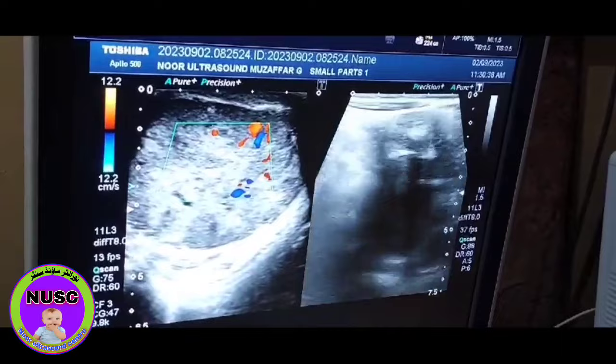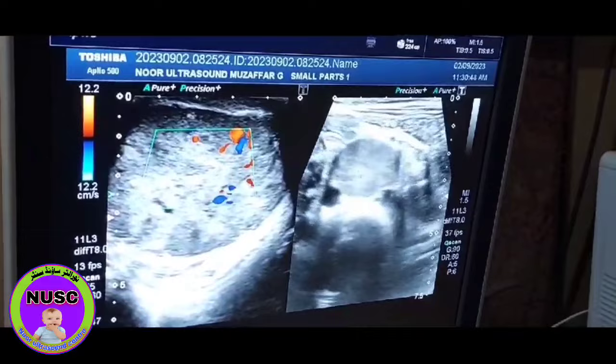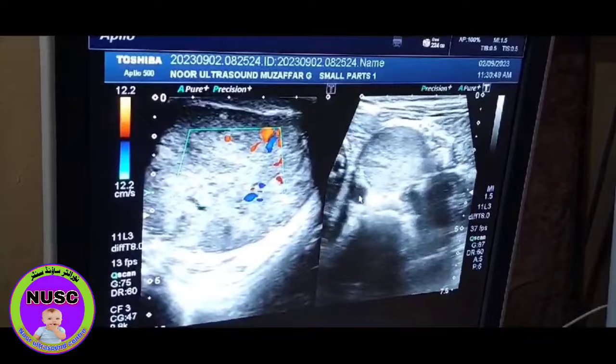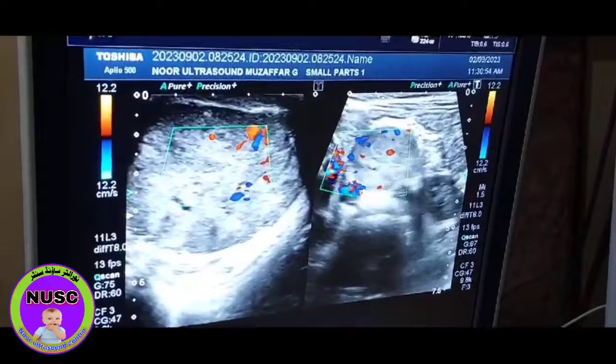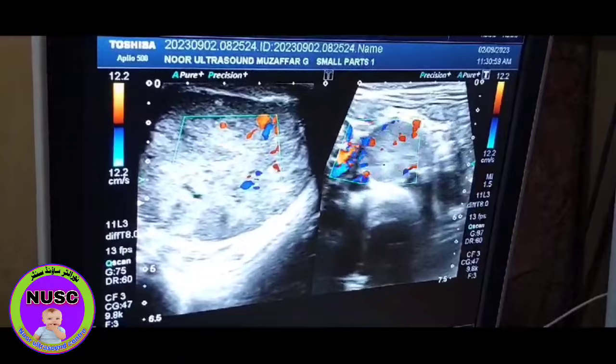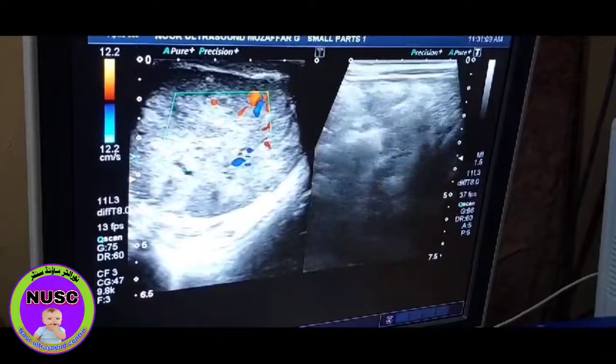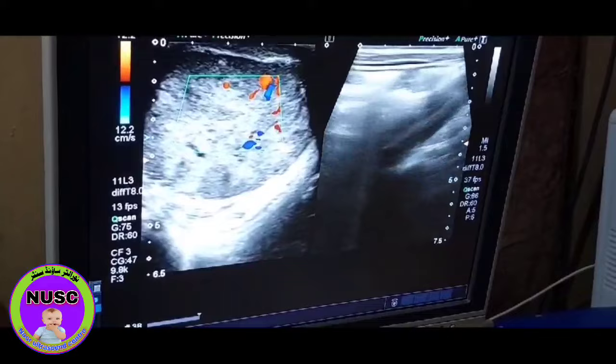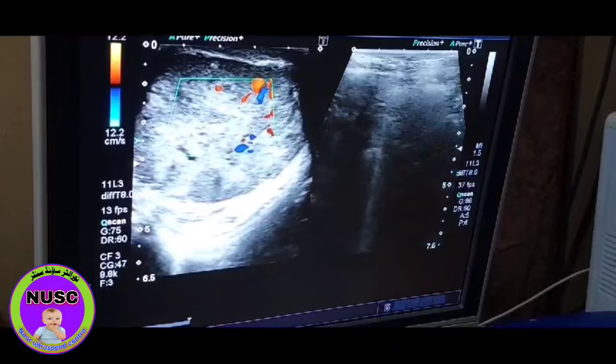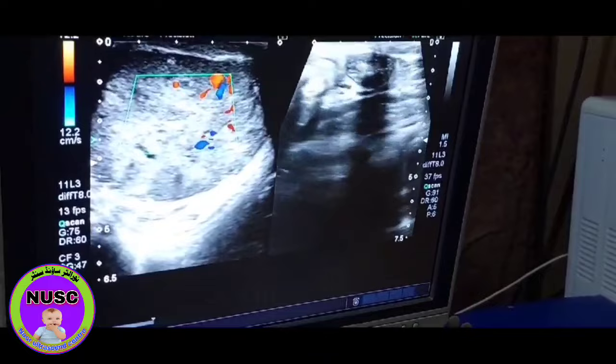Here you see this is the left kidney and this is the aorta. This is a vessel which is displaced by the mass. No other lymph nodes along the iliac vessels or along the IVC were observed.